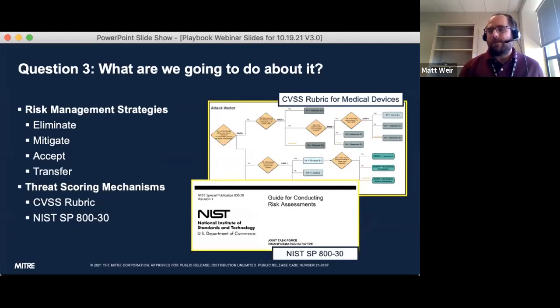An example of this is, let's say someone during the threat modeling process says, we assume our devices can only be connected to a secure network. Well, that really is not that helpful to the end users of your device, because that assumption adds a lot of different ideas in there, and it eliminates a lot of threats silently.